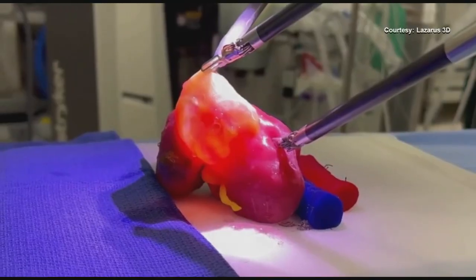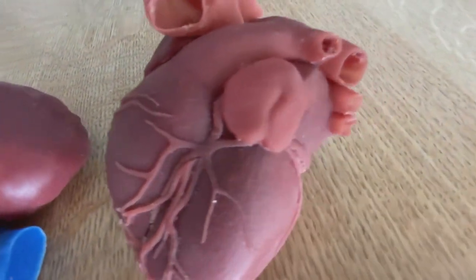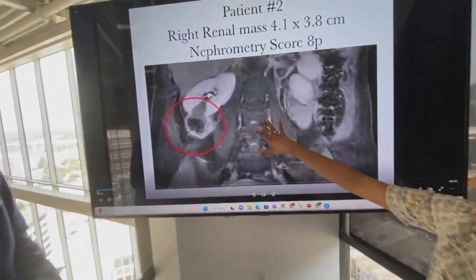Texas-born Lazarus 3D is using the latest 3D printing technology and cutting-edge materials to change the way doctors rehearse delicate and complicated surgeries.